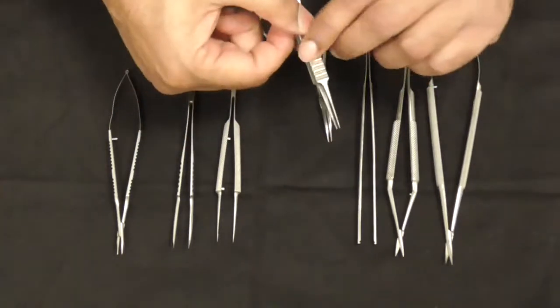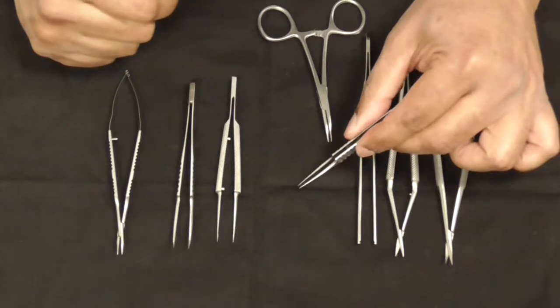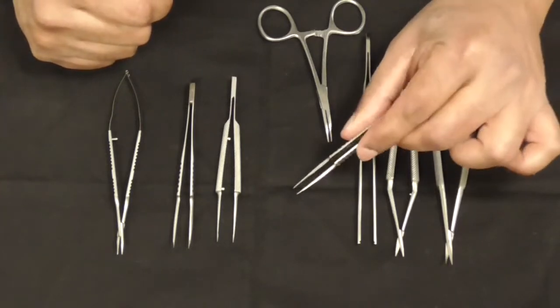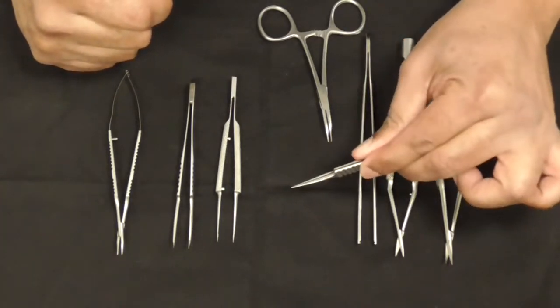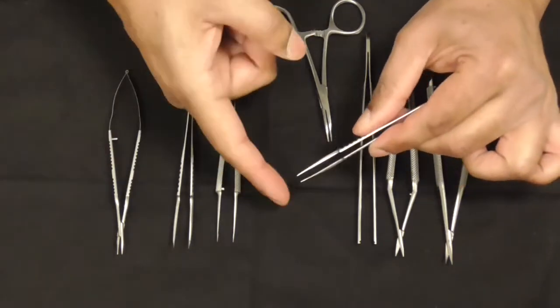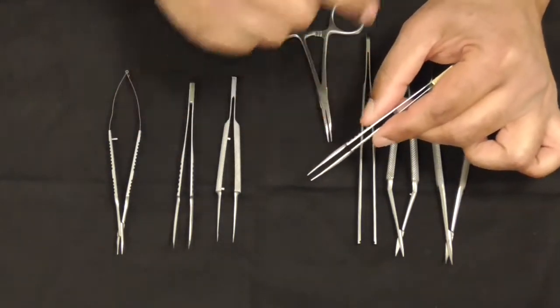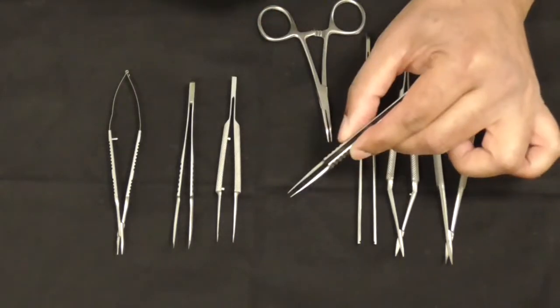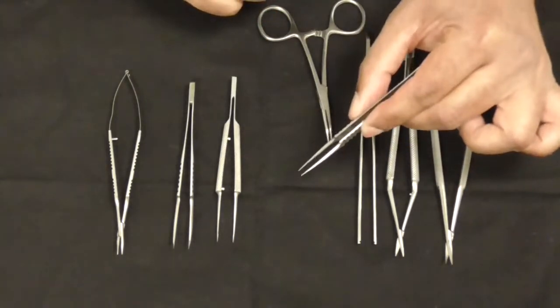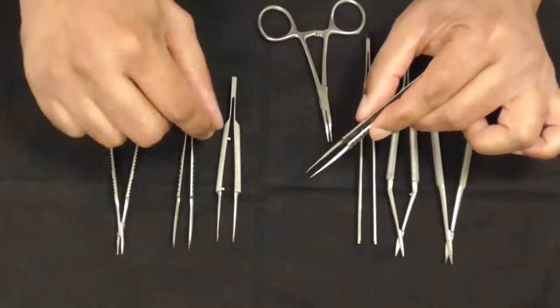Then we've got the 5s, which are the jeweler's number 5 forceps. They're straight and a bit sharp on the ends. Because they're sharp, you cannot put them into a vessel because you'll damage the intima. Never, ever put them into a vessel.